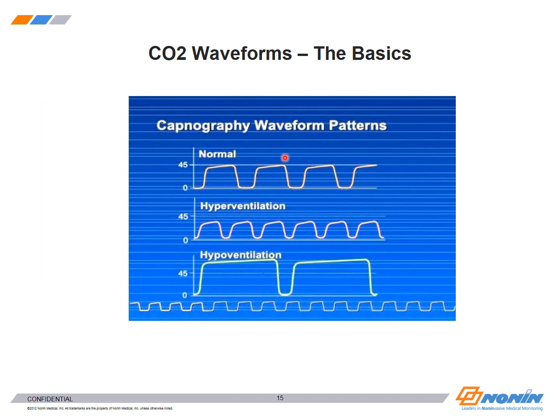And again, just kind of bring it into one slide presentation what hyperventilation and/or hypoventilation waveform would look like, possibly.